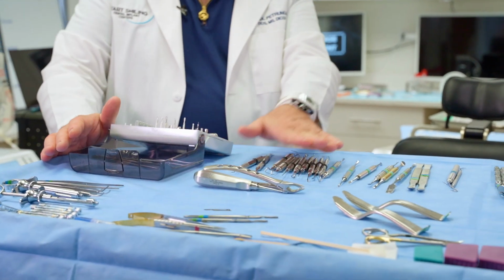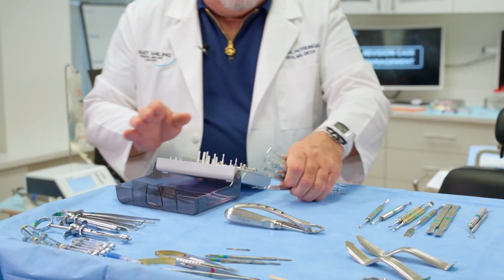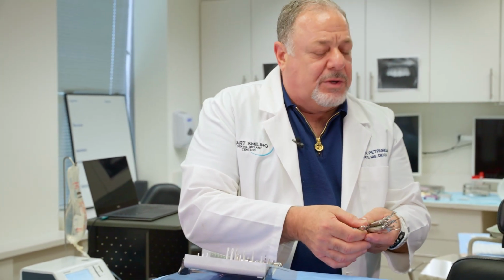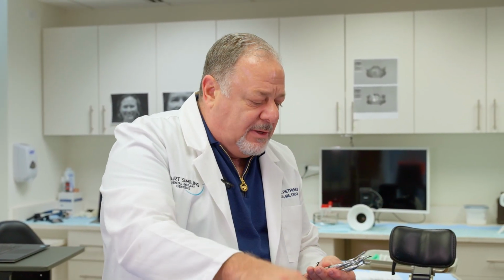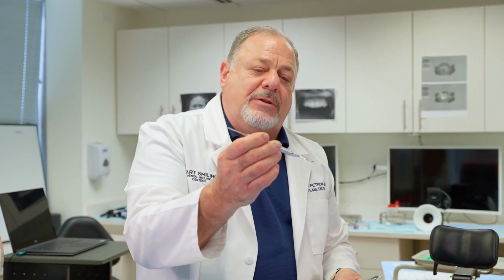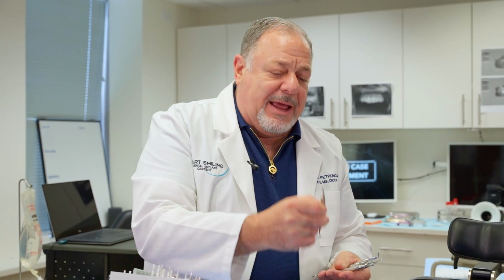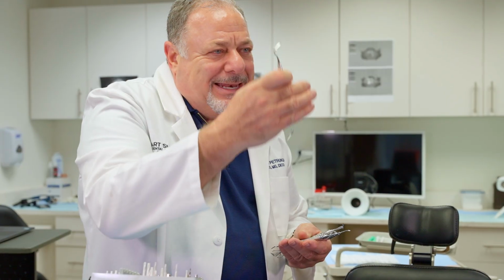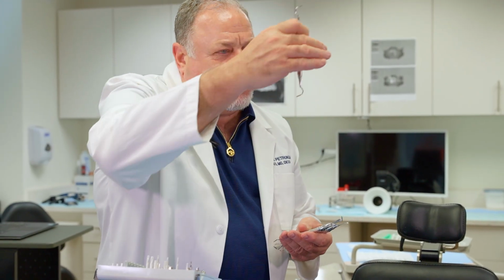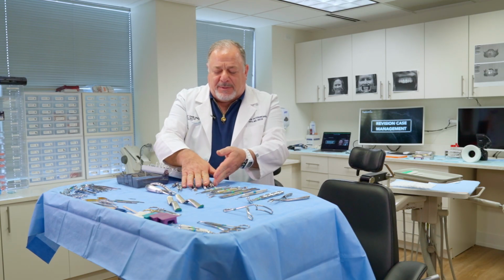Okay, this is our tunnel kit, which has probably 8 or 10 different types of knives and elevators in there. Pat Allen does a beautiful course in Texas on this. We have a sickle scaler, and then there are different types of tunneling instruments and elevators. These are meant for fine-tuned reflecting underneath the papilla to free up the tissue. You've got short and long Orban knives, which will do a little bit more deep dissecting, which you'll see in the case, to lengthen or increase the apical-coronal depth of the tunnel pocket itself, and then different elevators for different aspects of that procedure.